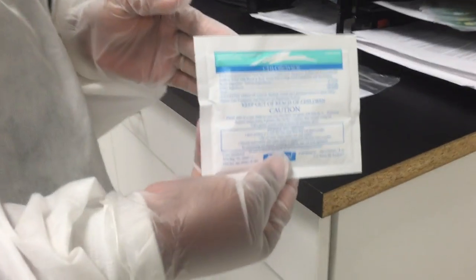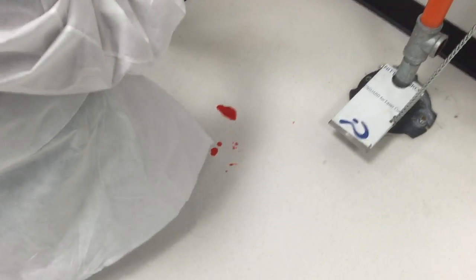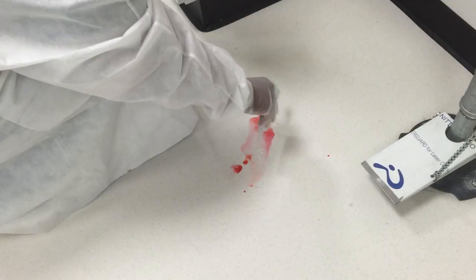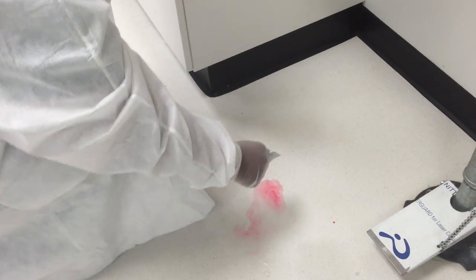We're going to take the chlorosol and we're going to pour it over our bloodstain or spill. And then once we pour our solution over it, we're going to get our towels. As you can see, it's kind of diluting it.